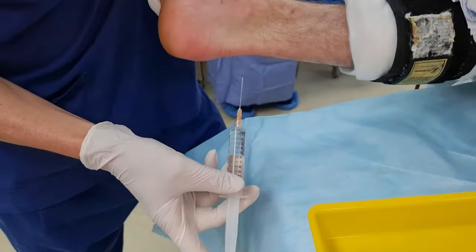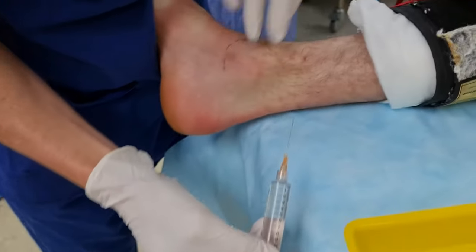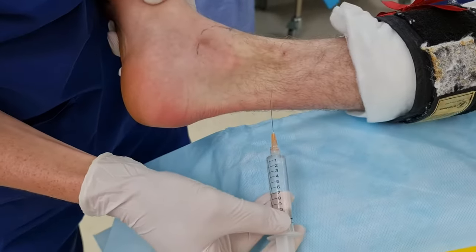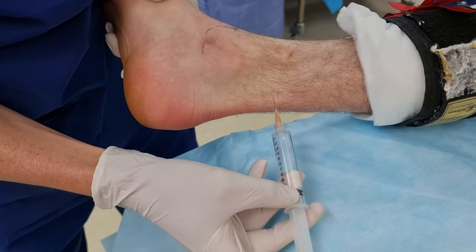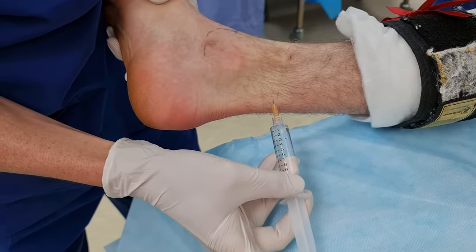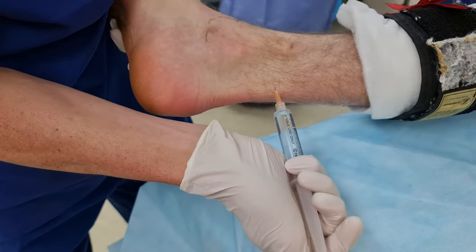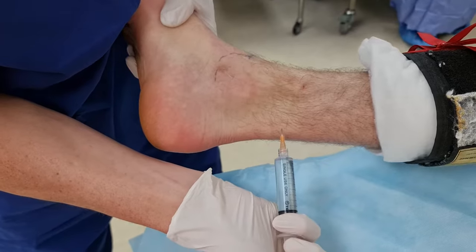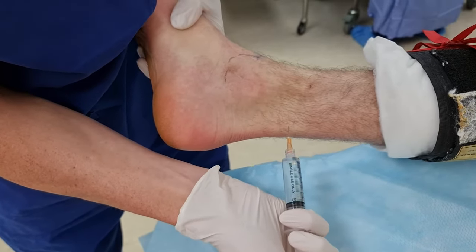We're doing an ankle block here. Peak of the malleolus, two finger breadths — we're going to come off the Achilles tendon, go straight to bone, aspirate, then retract about five millimeters and start to dump. Because the patient's asleep and can't tell us any paresthesia, we're going to fan from posterior to anterior.